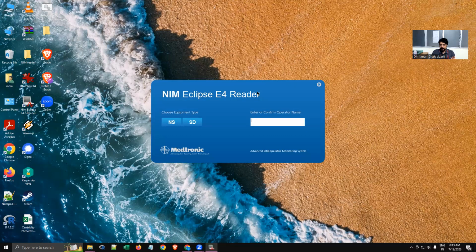Now, that device itself requires a lot of other software running in the background for it to work. If you switch on the interfacing software before switching on the processor, then the drivers which are required to run that processor will not be linked or started up. So you will not be able to use it. It will always keep showing "stimulator not connected" at the bottom as an error. So always make sure before starting a case, your processor is switched on.